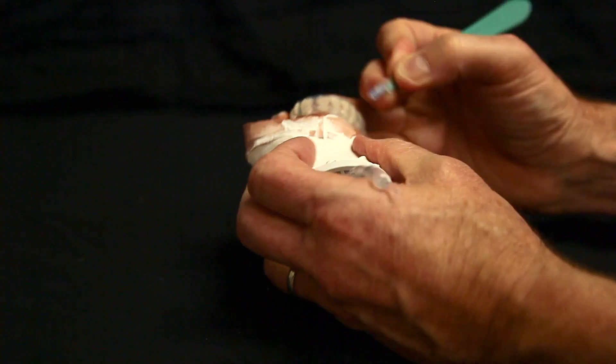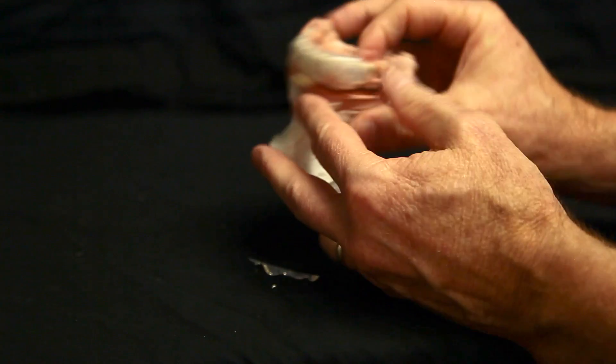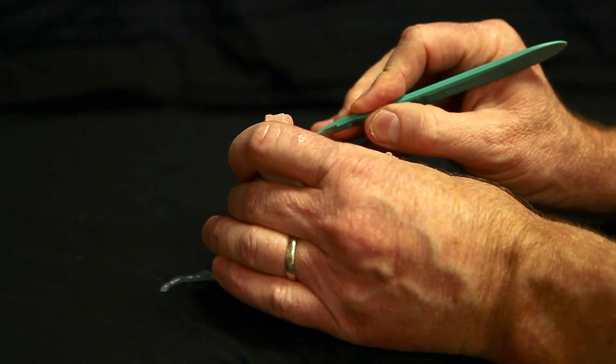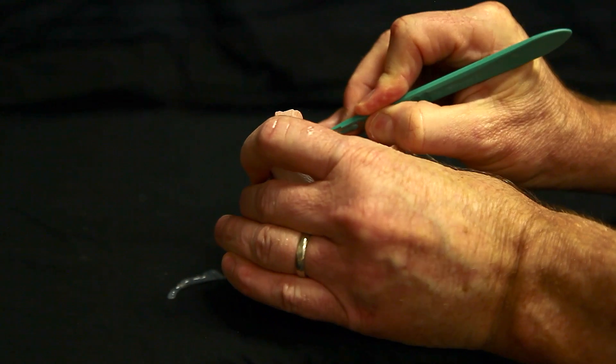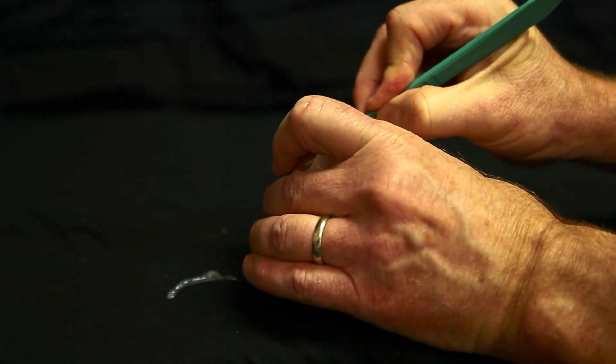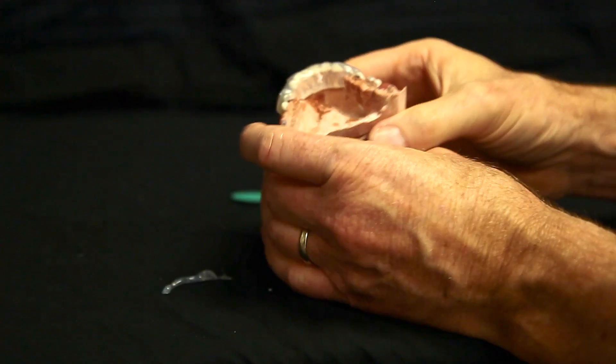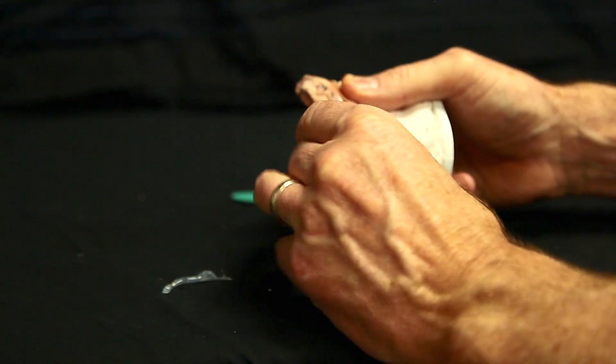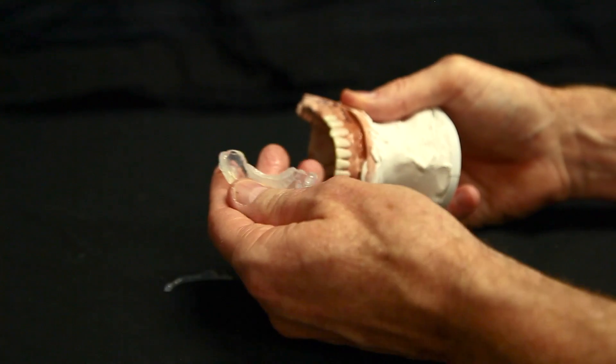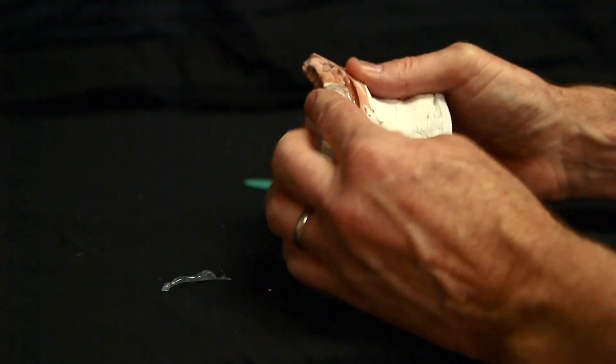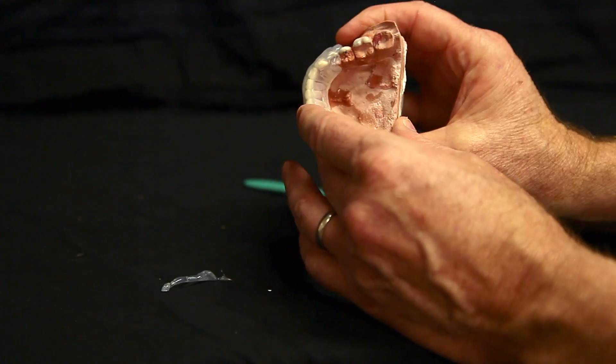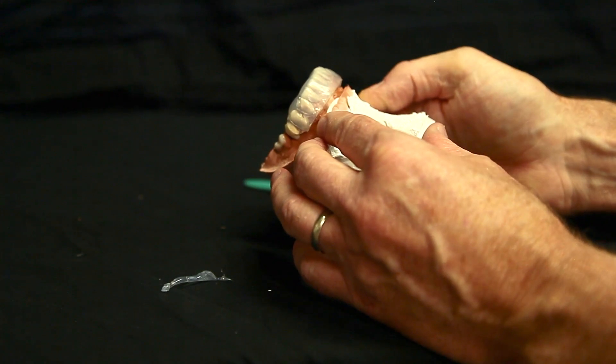So we had a nice even cut there, and on the lingual this is a little long, same thing. Just come in here and just cut that. And now when you peel this off, you're just going to very lightly tease it off. Nice adaptation. And that matrix is completed.